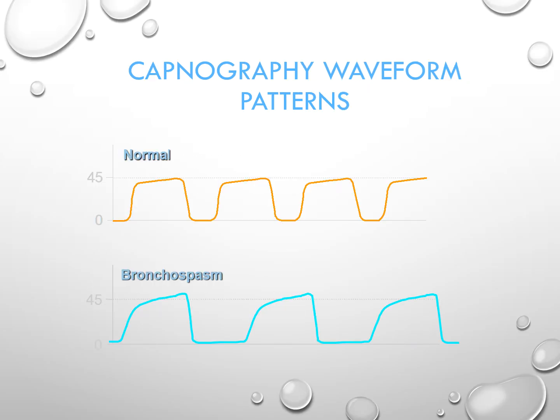So to build on the prior slide that talked about what happens when a patient has an obstructive airway from the standpoint of end-tidal CO2: in the top, the orange depiction is a relatively normal capnograph. It doesn't achieve an absolute plateau, but it's nearly a plateau. Slight upward ramp there, slight upward ramp.